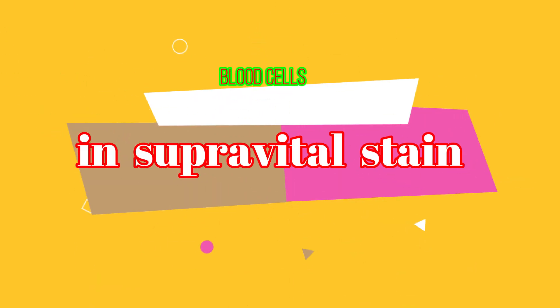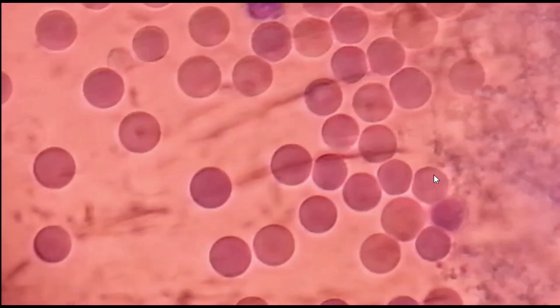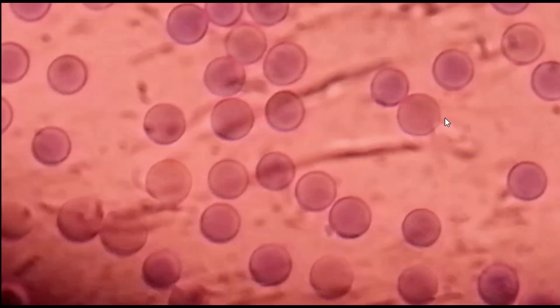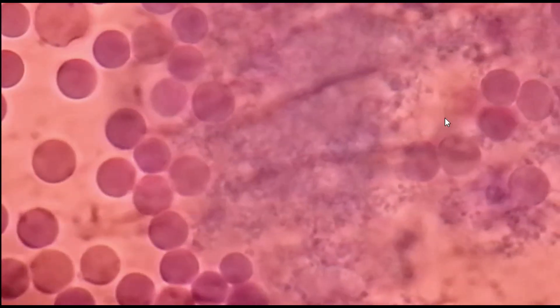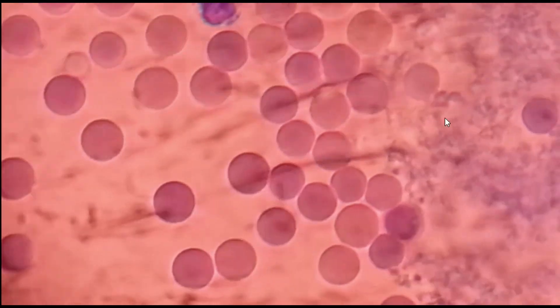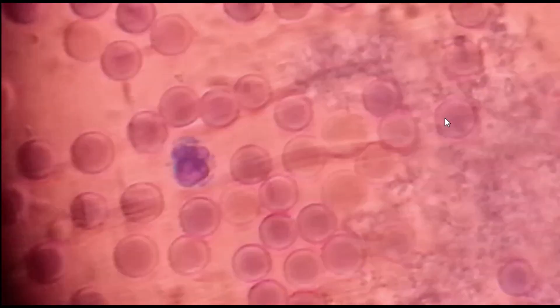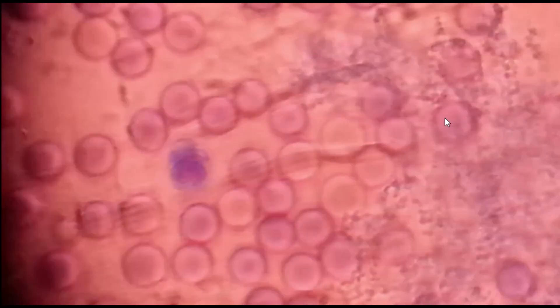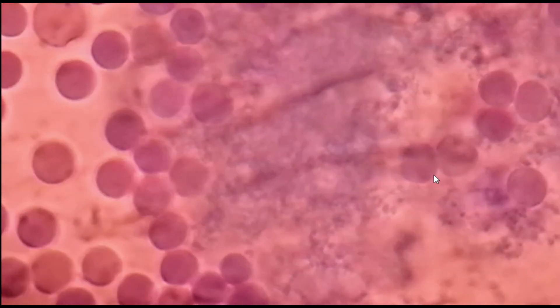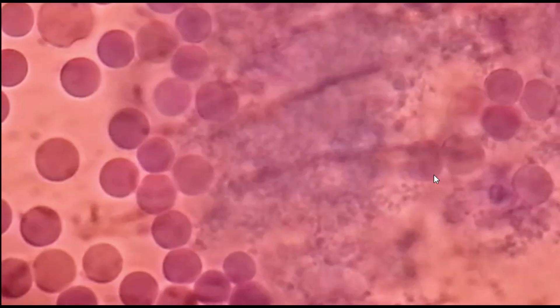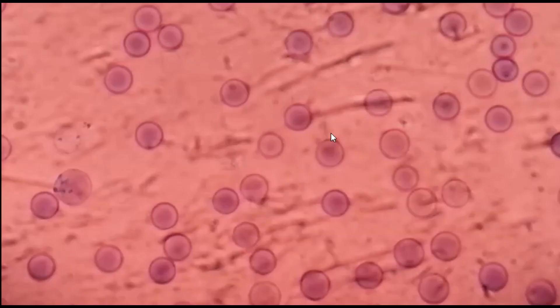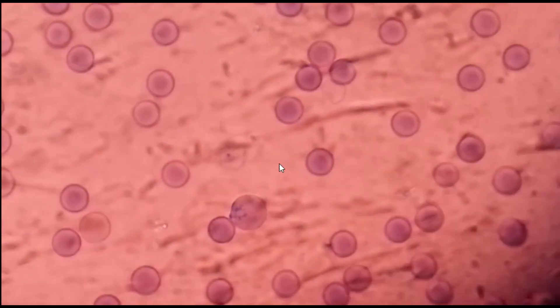Today we are concerned with observation of blood cells — red blood cells, white blood cells, and types of white blood cells — using supravital stain, that is a new methylene blue preparation. Taking one drop of mixed blood and two drops of new methylene blue, it was mixed and a cover slip placed over it, then observed at 40x objective of the microscope, that is 400 times greater than actual size.